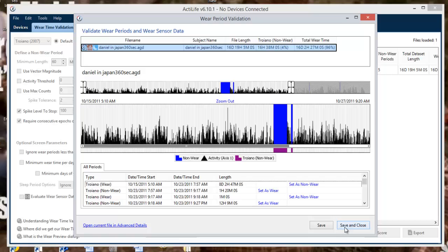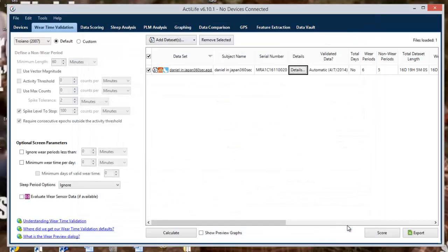These changes can then be saved and the floating window will close. Once the data set has completed its wear time validation, the file can be exported using the export feature in the bottom right corner, or moved to the data scoring tab by selecting the score option.